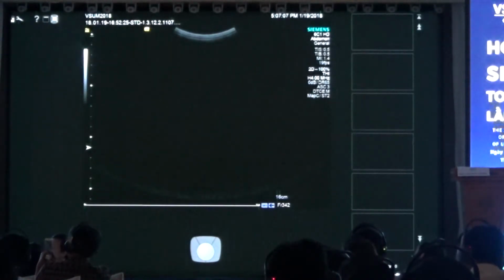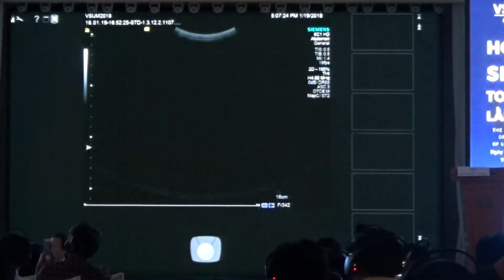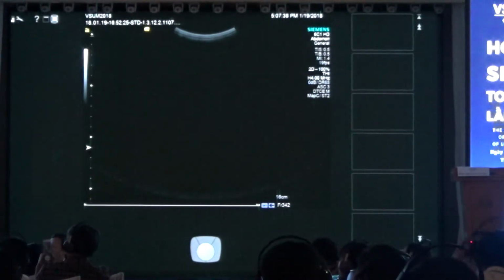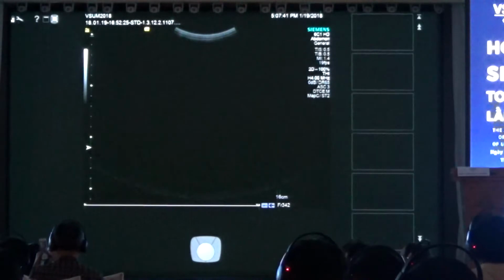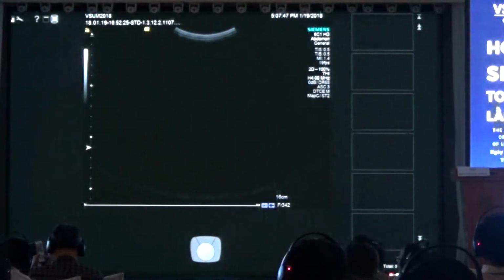First of all, what I've been telling was to know what kind of etiology that patient has. He's healthy, but we would assume that he might have chronic virus hepatitis C. We assume it, okay? And our question before the examination would be if that patient has no fibrosis or low fibrosis or liver cirrhosis, because it will be different drugs, it will be a longer treatment, and we have to add ribavirin in certain circumstances. So we have a good answer which we get.